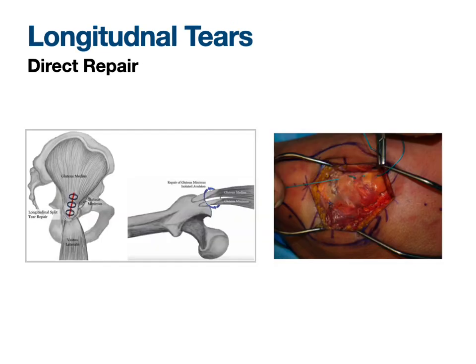Now, this is quite an extensive classification, but in reality, we could have longitudinal tears which involve just a direct repair. So there is a rent in the gluteus medius, and if you could just stitch it the way we have shown in the picture, that will suffice.